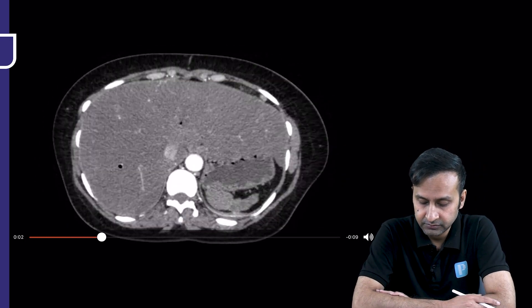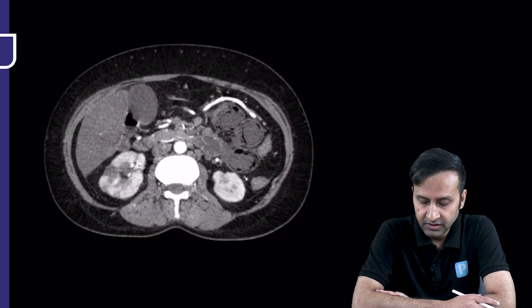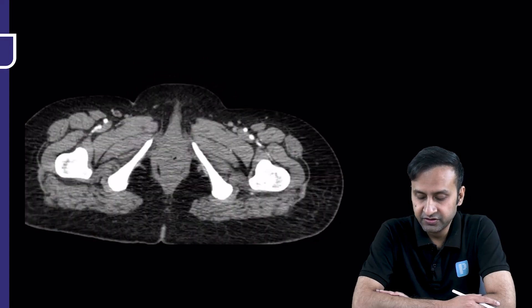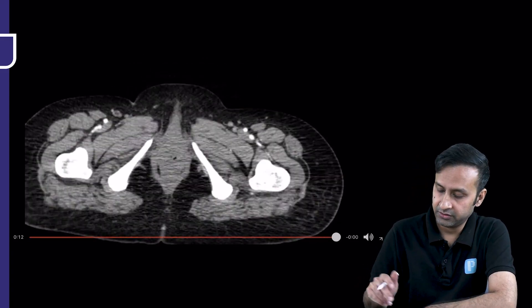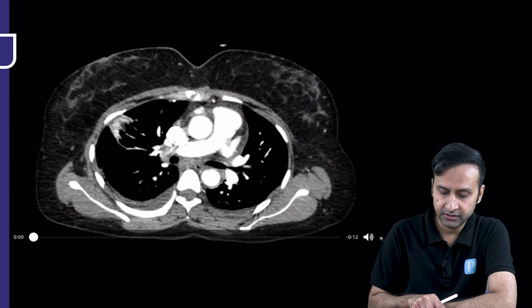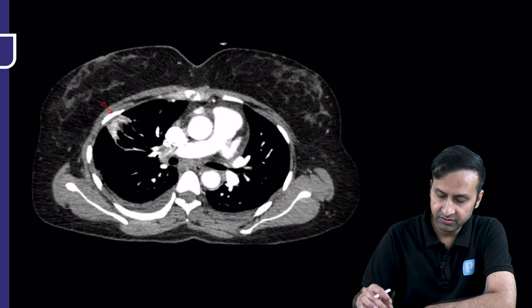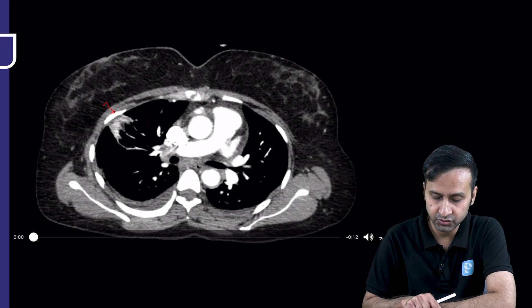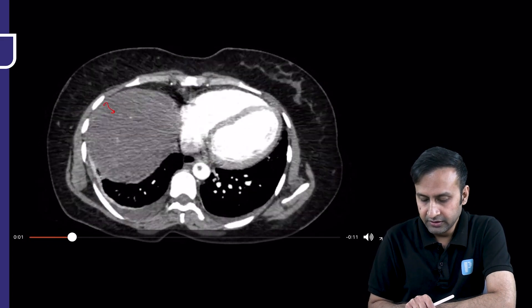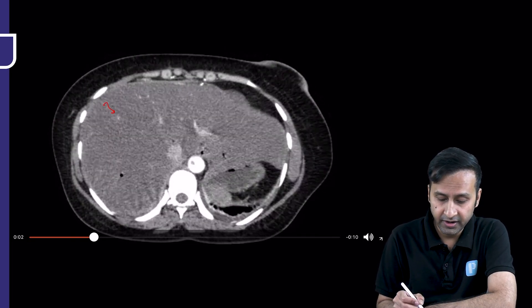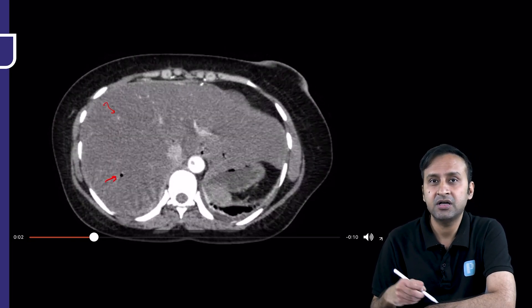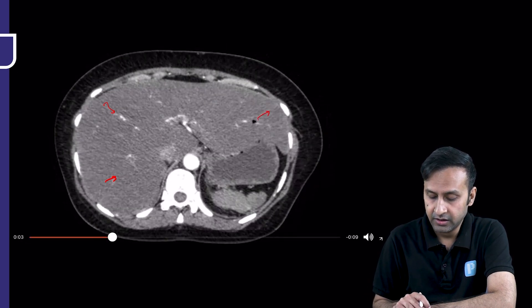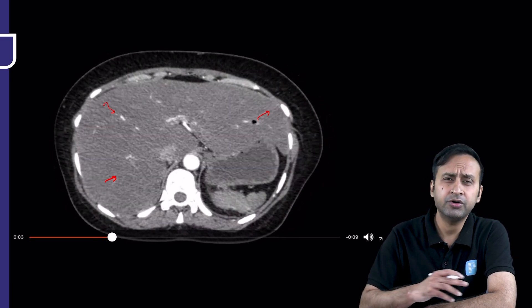This is the CT scout image — I want you to look at it from top to bottom. Because the physician told us about the DVT history, we decided to do a CT angiography rather than a plain CT. In the lung parenchyma, you can see peripheral-based areas — possibly atelectasis or pulmonary infarcts; the main pulmonary arteries looked quite normal. Then in the abdomen, there are air foci within the portal venous branches of the liver, and the liver is also exceedingly fatty.